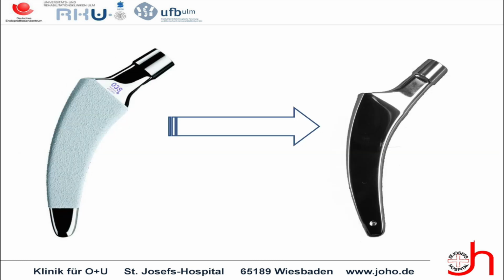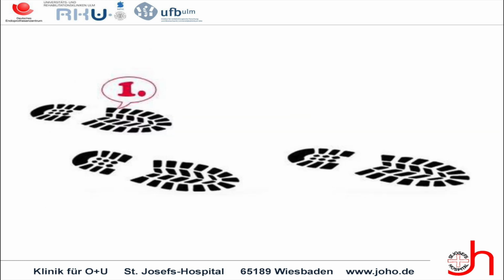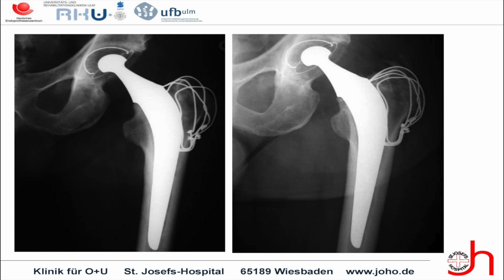So what we thought of, we had an idea to transfer the cementless Optimys into a polished cemented version, and thanks to Mathys company, they produced a polished prototype which we could test biomechanically. So we had 3 steps planned. The first one was about the cementing technique.